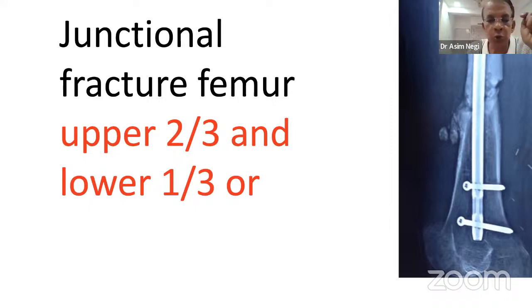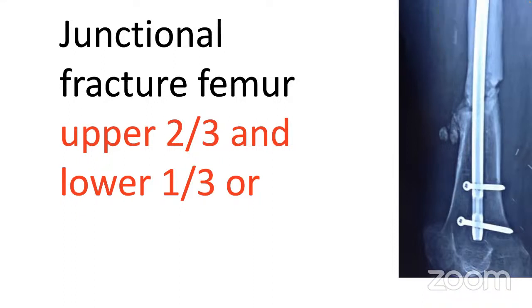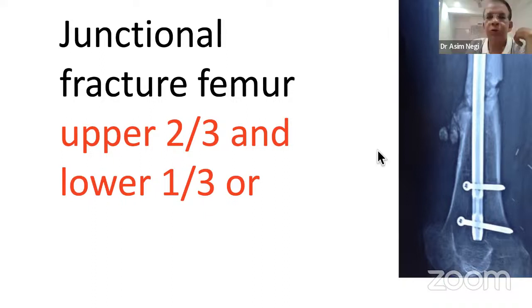And sir, previously we used to over ream, say up to 12, and use a 10 or 11 nail as a joystick intermediate device. But now some companies have already made an instrument which is something like 9 mm. So once you have made the entry in the proximal femur, you can use that instrument to have solid control on the proximal fragment. Yeah, that is the same part of an AO. So, it's a beautiful instrument they have created.